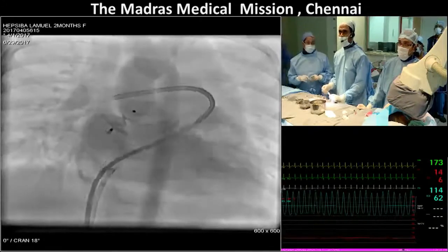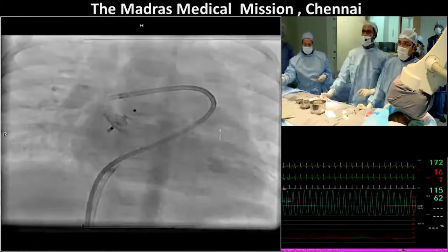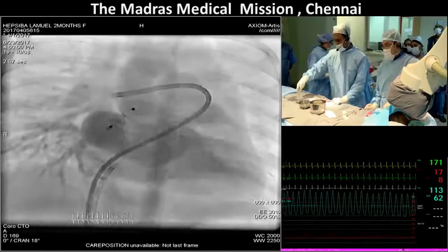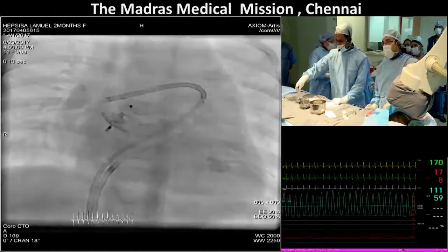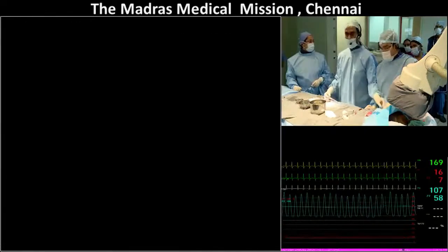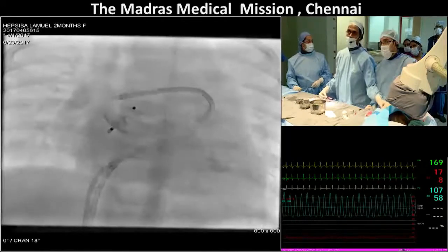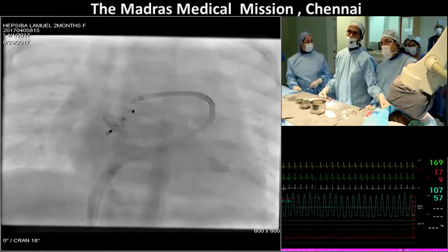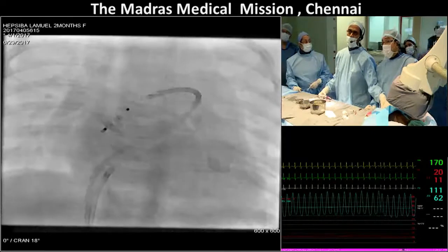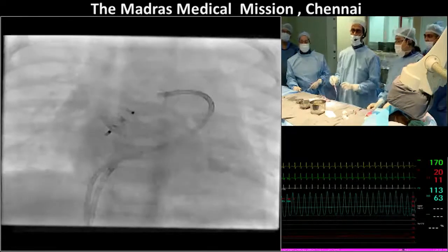Any comments from the audience here? There's a comment back there. Sheila, Nick Hayes from the UK. Fantastic results. I'm just wondering, how did you decide on using an ADO2? Did you think about using just a septal occluder, a small septal occluder? That would have been quite flat too. How did you come to a decision about using that particular device?